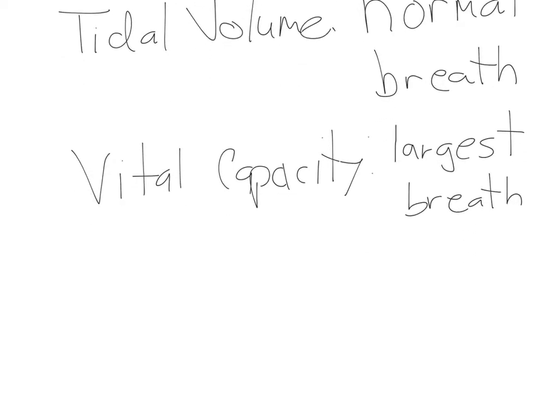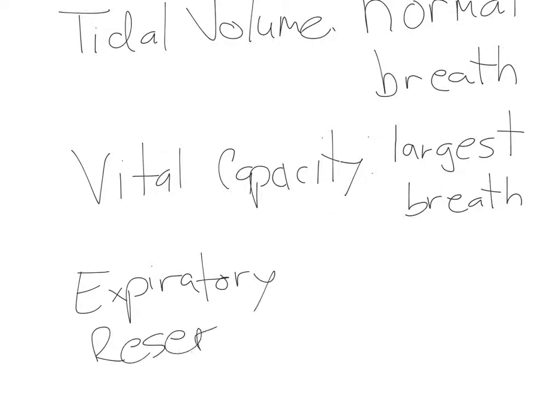That's a vital capacity breath. And the last one is the one that's usually the hardest to accomplish. It's called the expiratory reserve. Now with an expiratory reserve breath, the expiratory reserve breath is the one that comes after a tidal breath. So you take a normal breath in, breathe out, and notice that you have to trust me because you can't see, but I breathed out and I did not take another breath in, and I'm still talking.